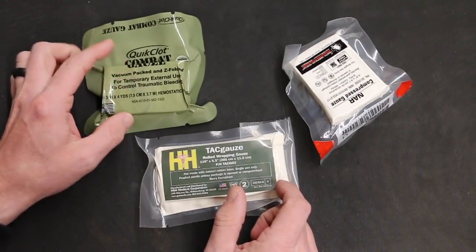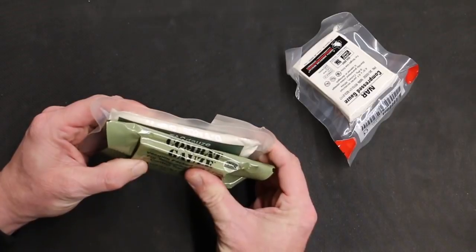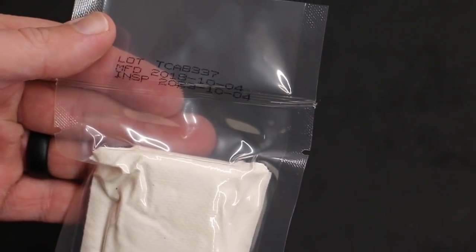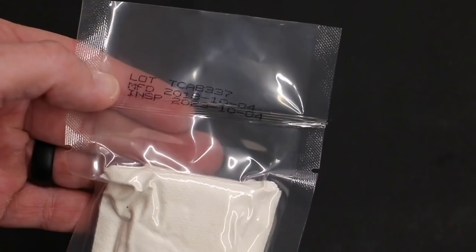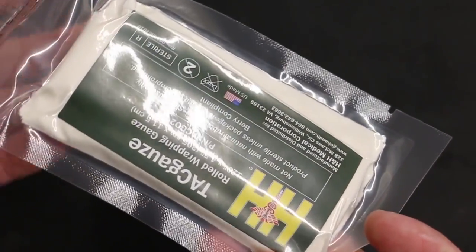You can see the gauze has a manufacturer date and inspection date. This gauze does not expire. You just have a recommended date that you can inspect it to make sure that it's still vacuum sealed and still looks intact.